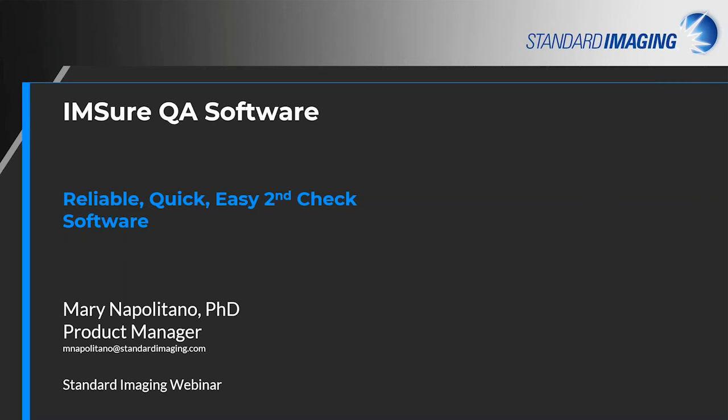My name is Mary Napolitano, and it's my pleasure to talk to you today about Standard Imaging's IMSure QA software. In short, IMSure is second check software that is reliable, quick, and easy to use.